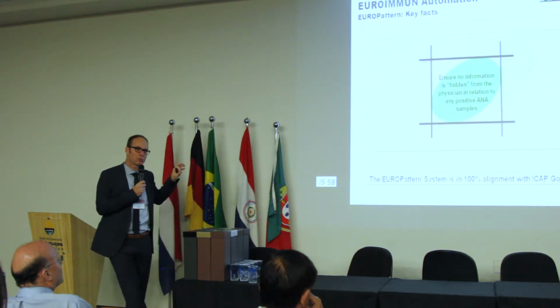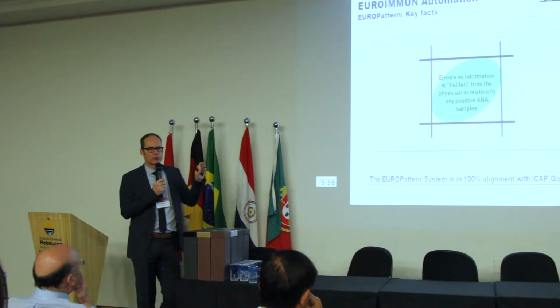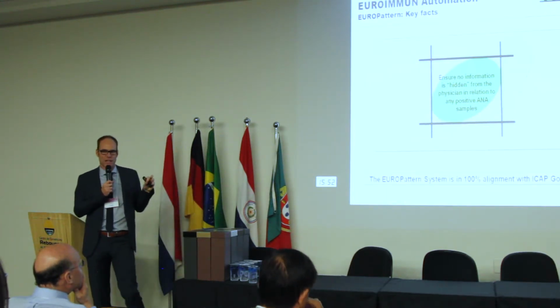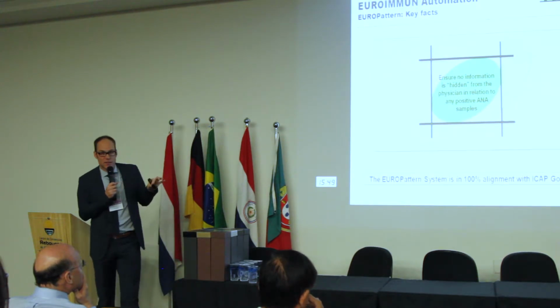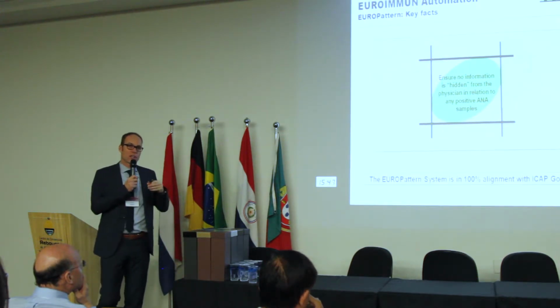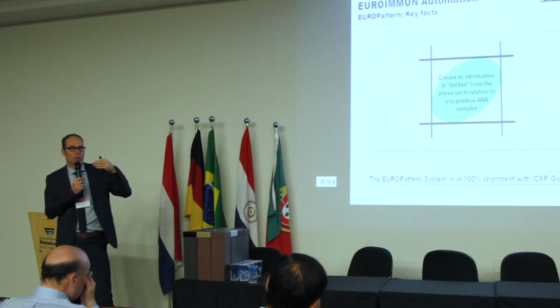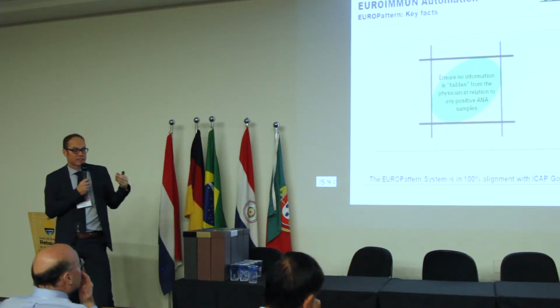And I think this is important because you all know if you have different technicians reading the slides, you always get slightly different results. And automated systems are one huge advantage to get a more homogeneous reading, a more standardized reading.